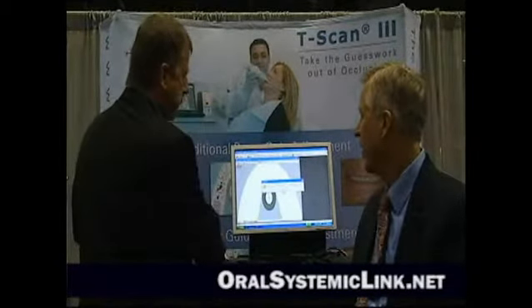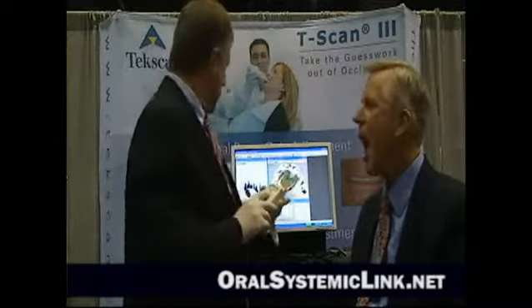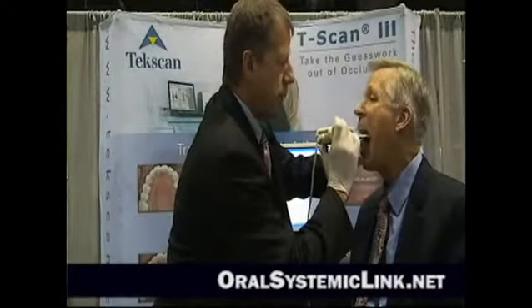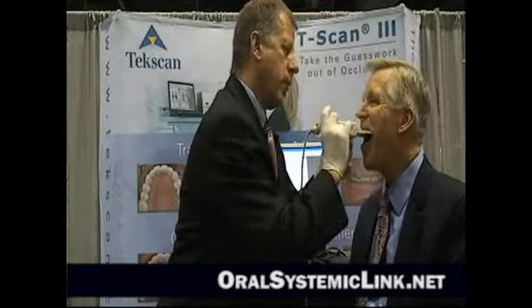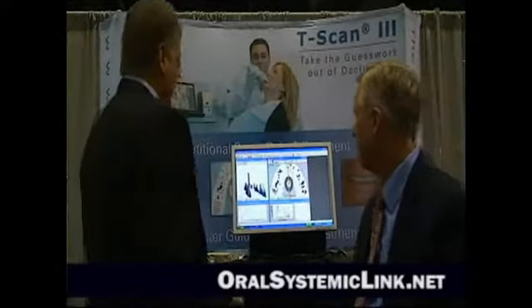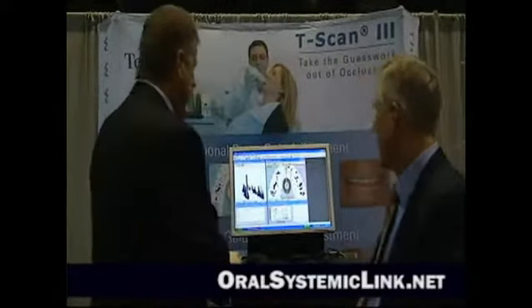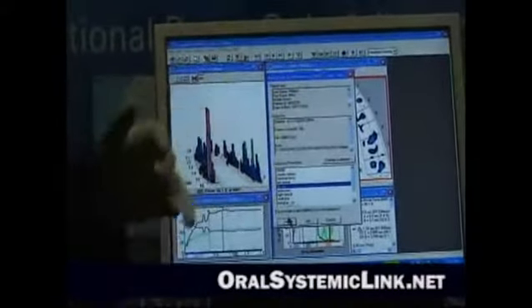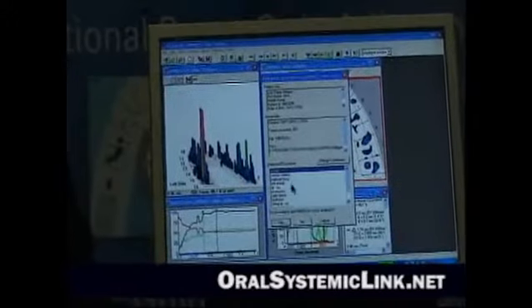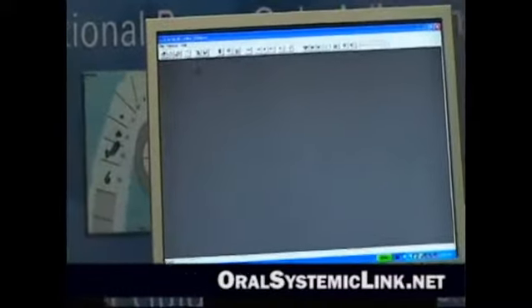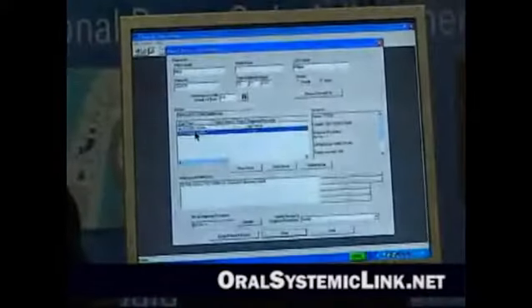Now we'll also do a recording of the excursion. Bite down and hold it. Slide right. That's all there is to it — not a problem at all. We can have you do more if we need to. First I'm going to save the data. The first one I'm labeling as a habitual bite. The second one was a right lateral, so I'll just hit right lateral — that makes it easier to find in our software.